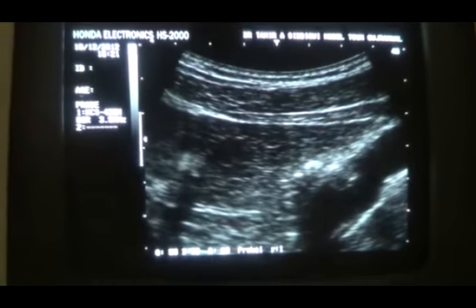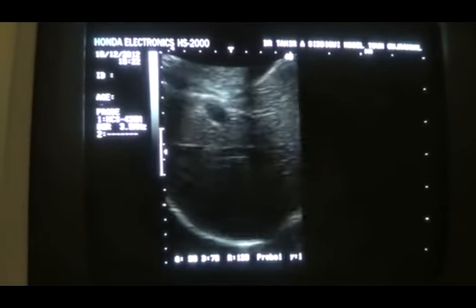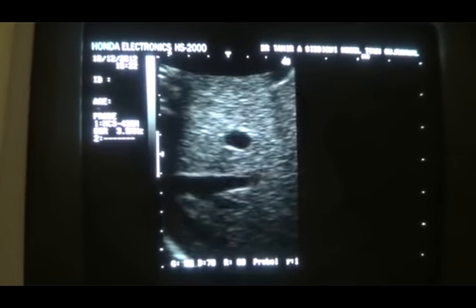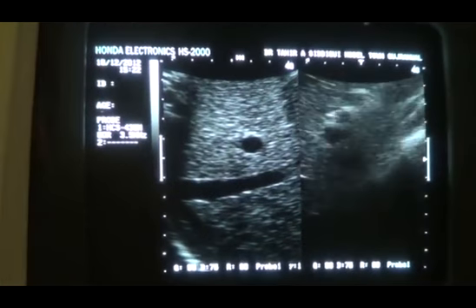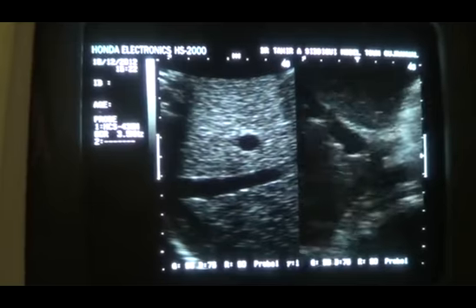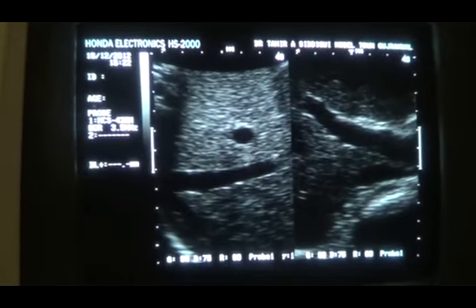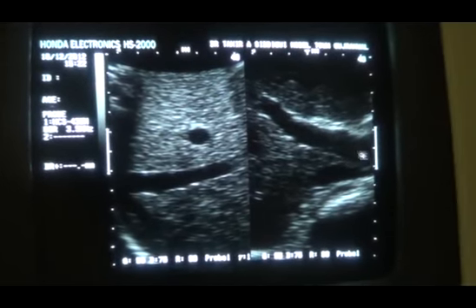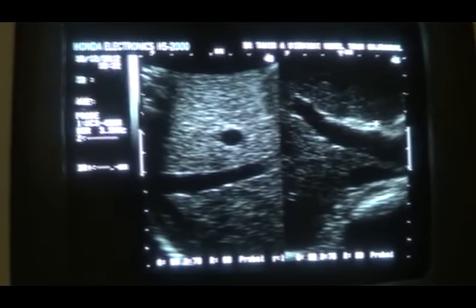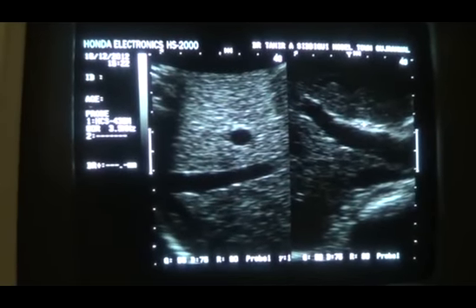Magnifying. This is the hepatic vein with no echogenic border around it, and this is the portal vein with echogenic borders around it. See the vessel, no echogenic border. This is hepatic vein. This is the portal vein because it has echogenic border around its anterior wall, and these are called the periportal echoes.